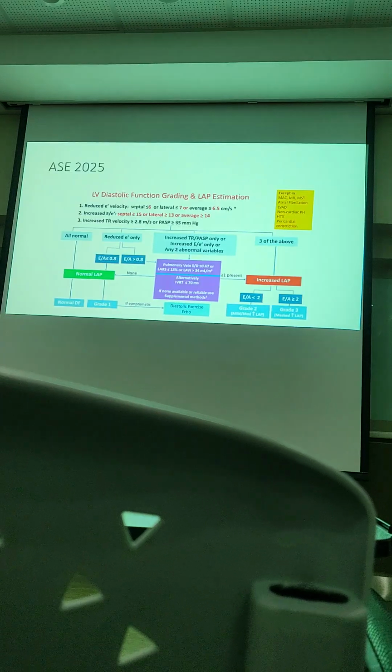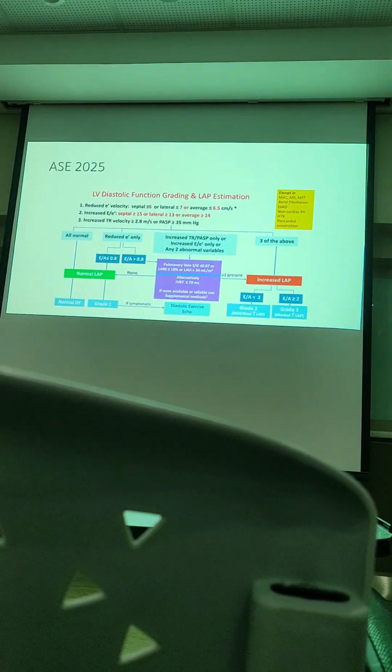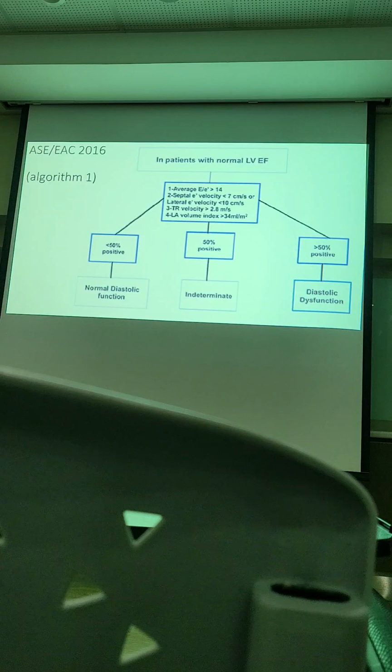Okay, the diagnostic criteria. The ASE, the American Society of Echocardiography, just published a guideline last month, July 2025. So this is the new guideline. It looks nice, color lawa, tapi actually I prefer the old one. Okay, the old one looks easier to understand.